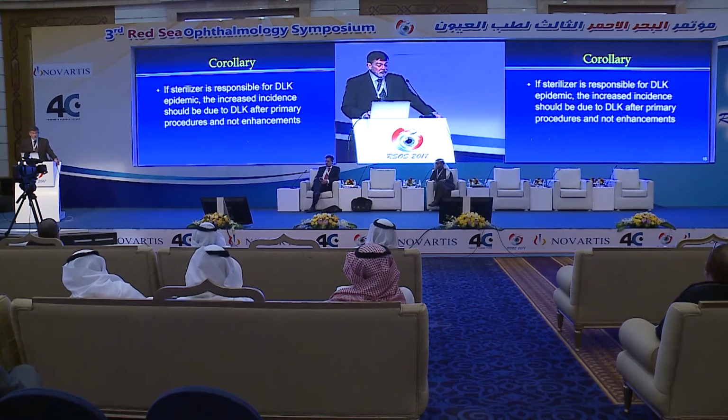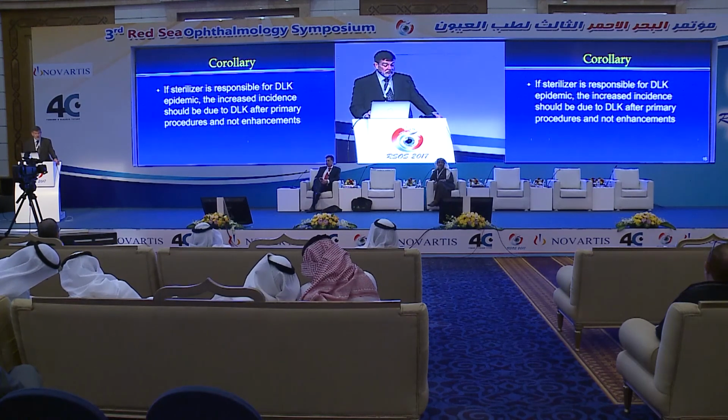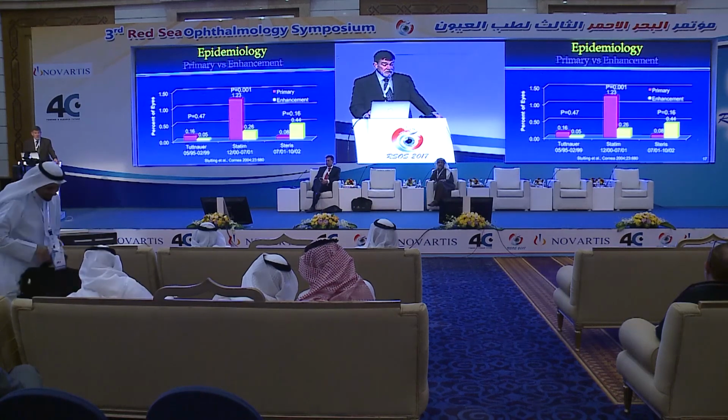We thought that if the sterilizer was responsible, the increased incidence should be DLK after primary procedures and not enhancements. These are our incidences after primary and enhancements. And you can see during the period that we used the sterilizer, indeed, primary procedures created more DLK.